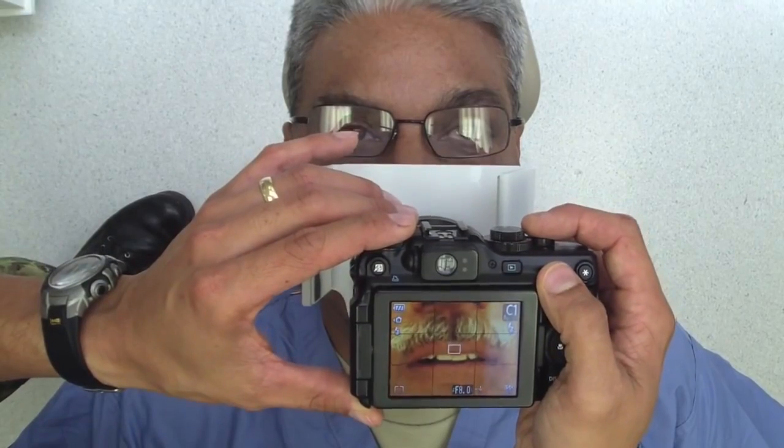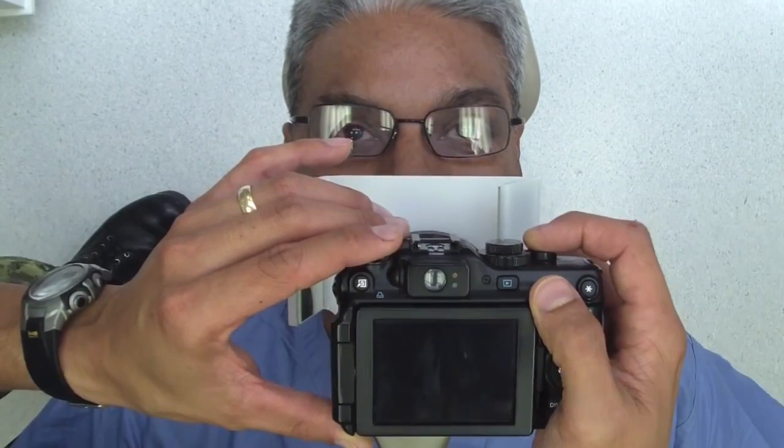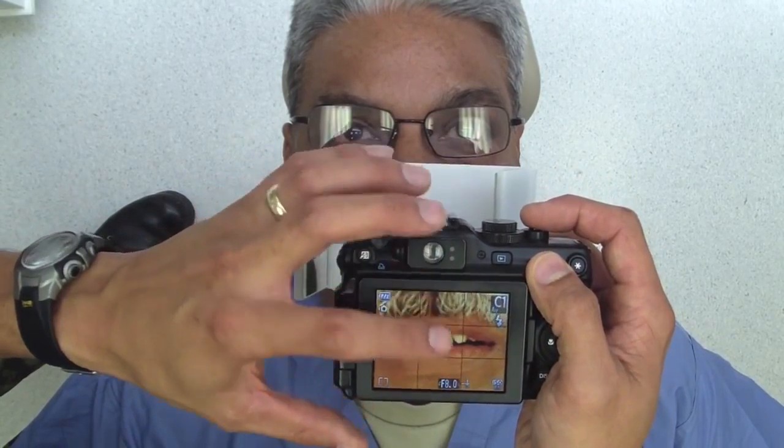Okay, so that's that with the retractors. I'll take that from you. Okay, one of the last photos that you can take, we've actually been questioning it, is lips in repose. Lips in repose is sort of just getting the patient to relax and open their mouth. Just relax, and you want to see how much maxillary anterior tooth show you get. And then you can zoom in, use your macro lens. And this is just an aesthetic. So this is called lips in repose. Just get the patient to open a little bit, just relax the lower jaw. And now what we're looking for is how much tooth display does a patient have when they're just relaxed.